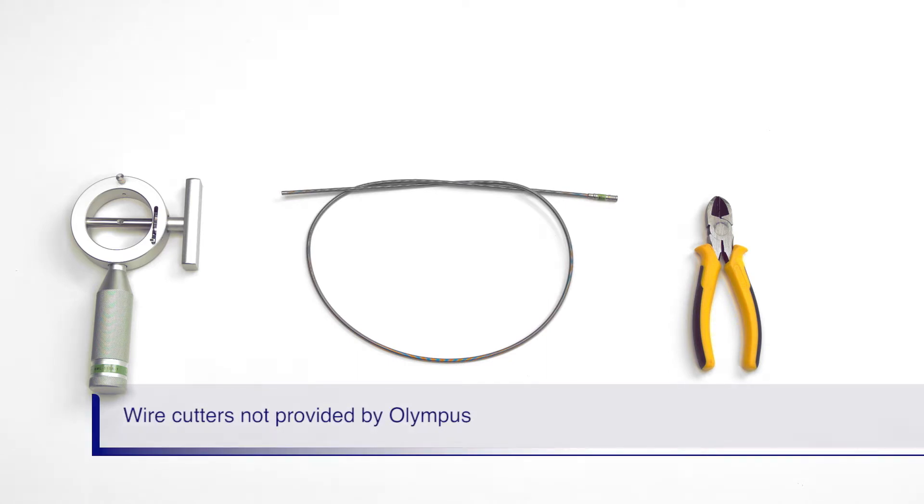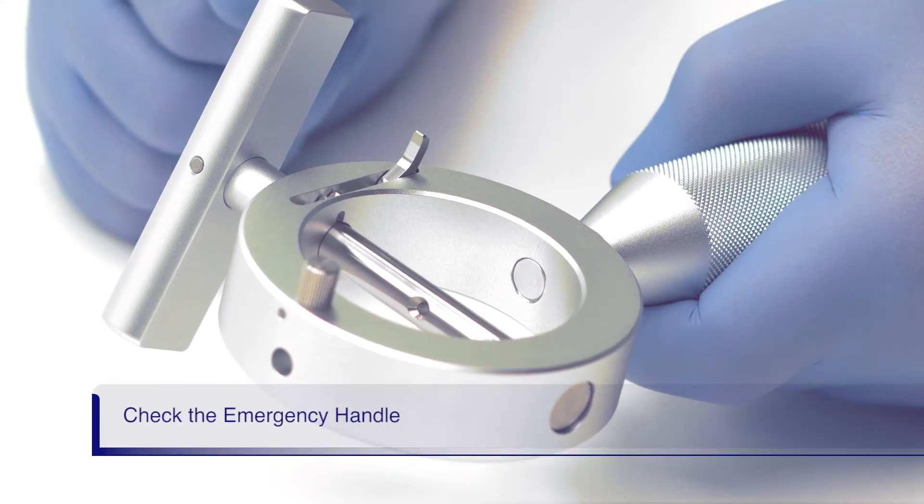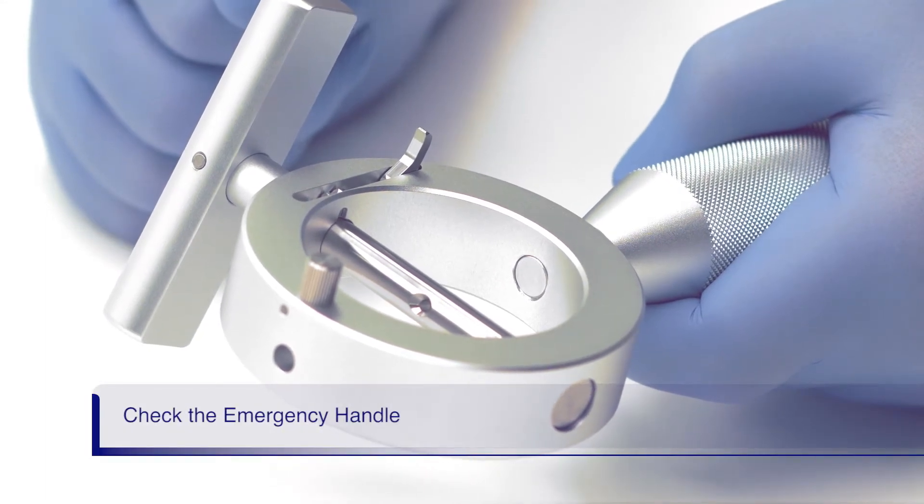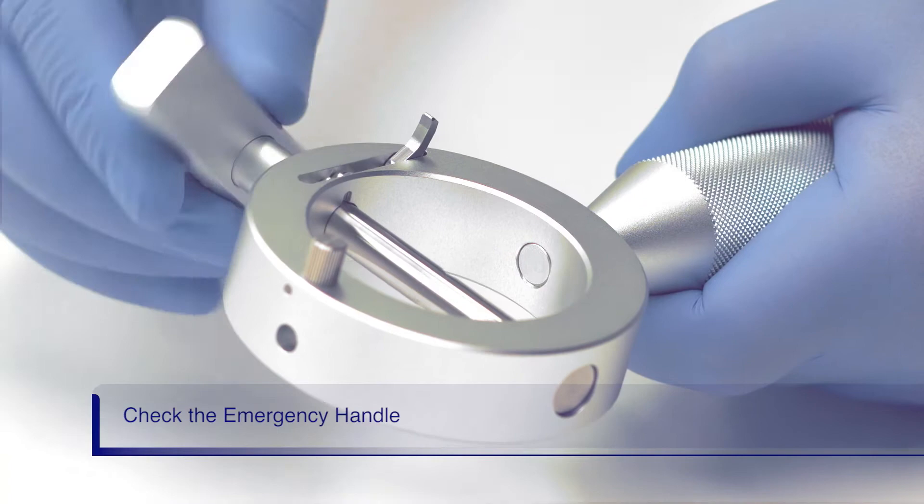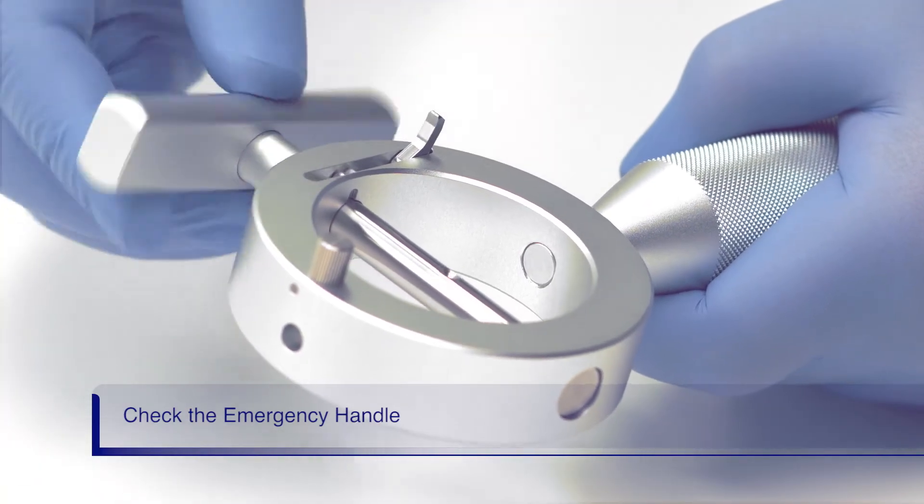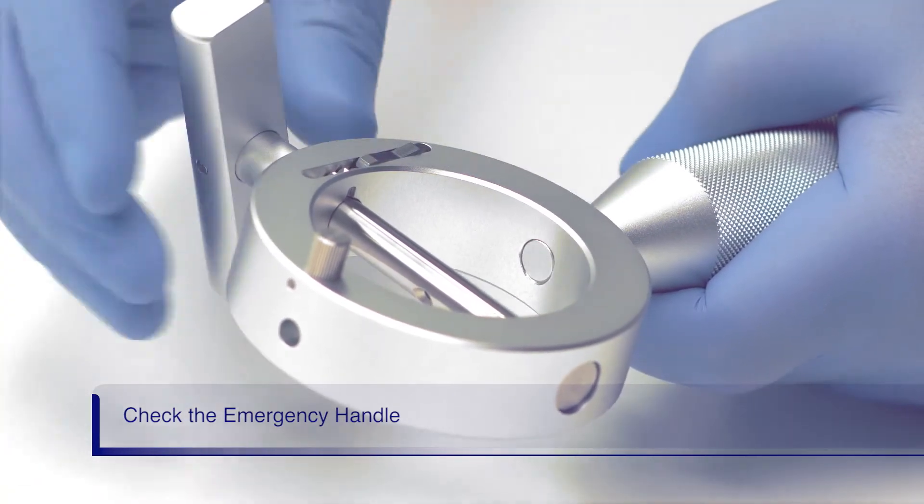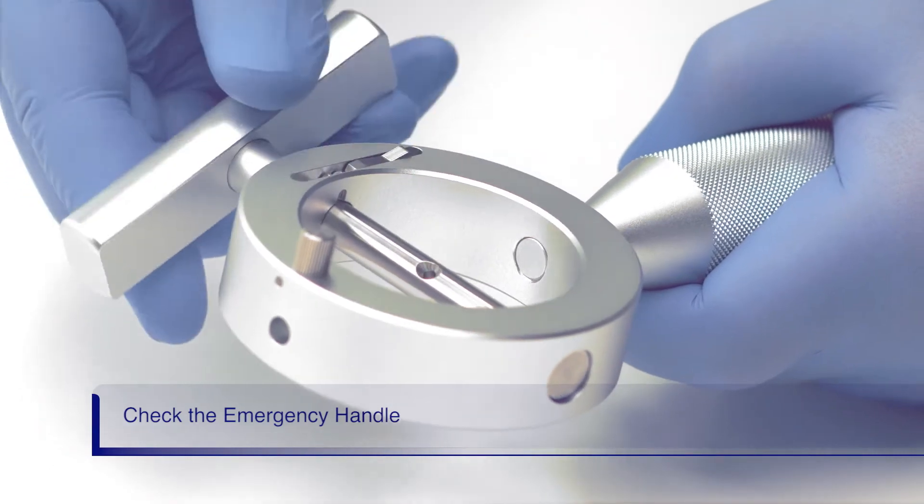Before using the emergency lithotriptor handle, ensure that the rotatable bar can freely turn and confirm the ratchet lock works by engaging and disengaging it at the handlebar.